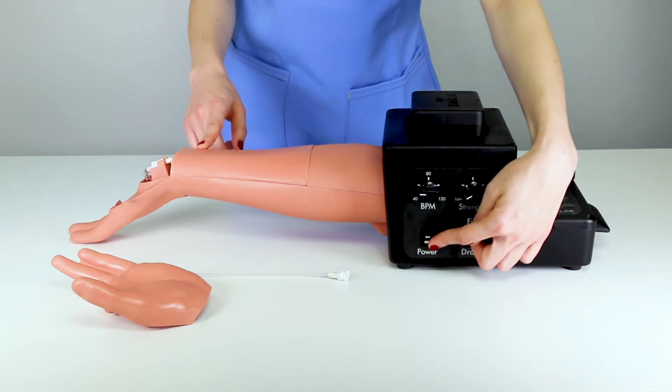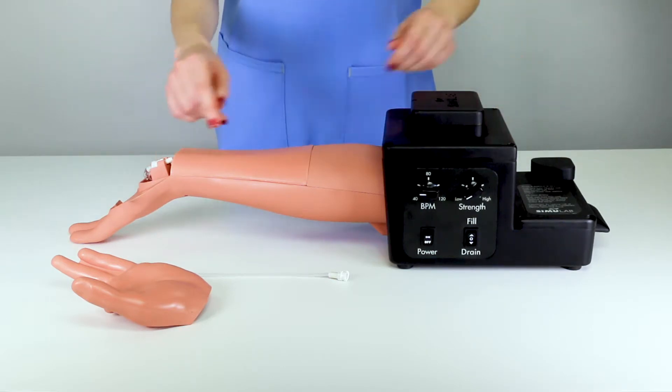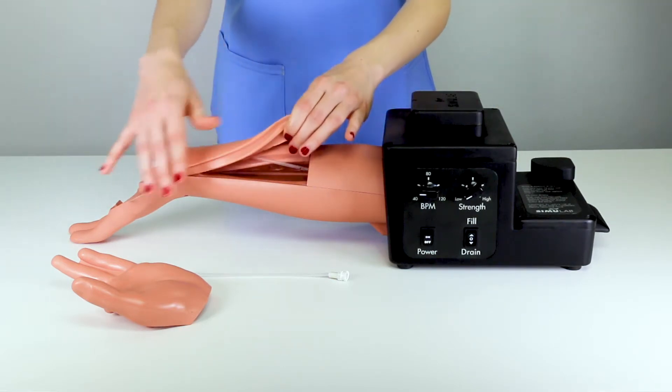With the trainer turned off and the fluid fully drained from the fluid line, remove the tissue and the arm cap to access the artery.